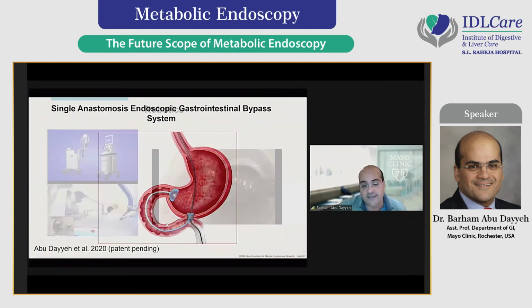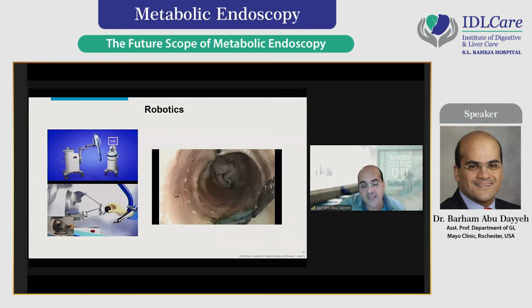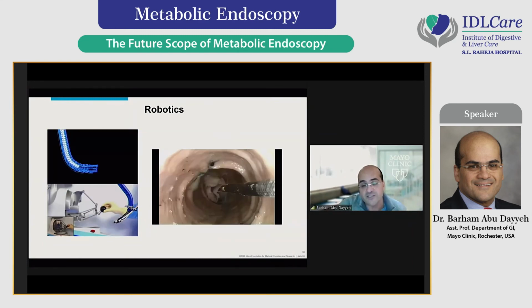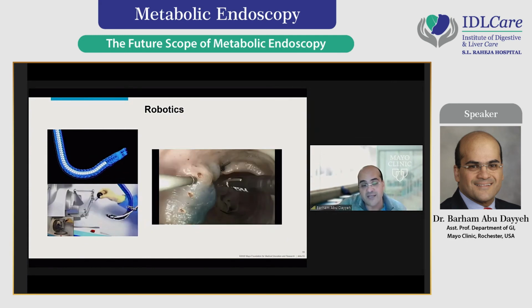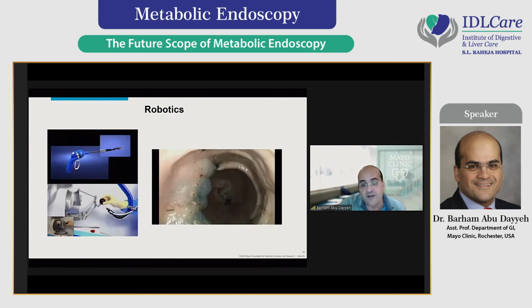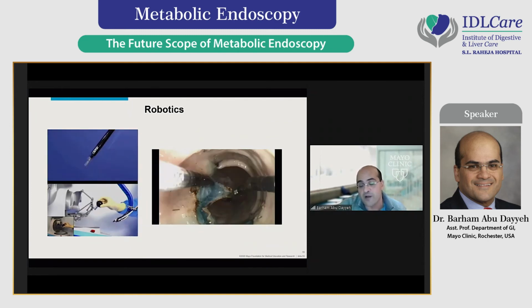And finally, there's no lecture that talks about the future that is complete without the future of robotics. This is using, in an ex vivo model, a robotic system in order to create a wide margin endoscopic mucosal resection to enhance plication or gastroplasty techniques. You could see here with robotic, the ability to triangulate means that you could now do these very wide resection margins with ease and without difficulty. And now we have suturing platform that you could use to approximate muscle against muscle in order to enhance the durability of the techniques that we are all doing together.